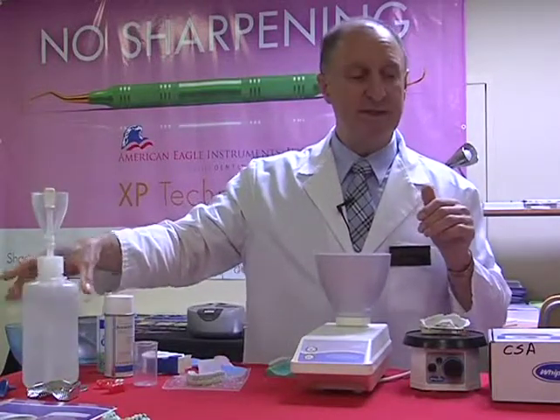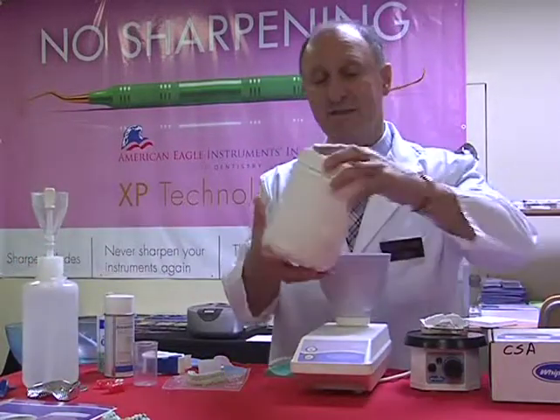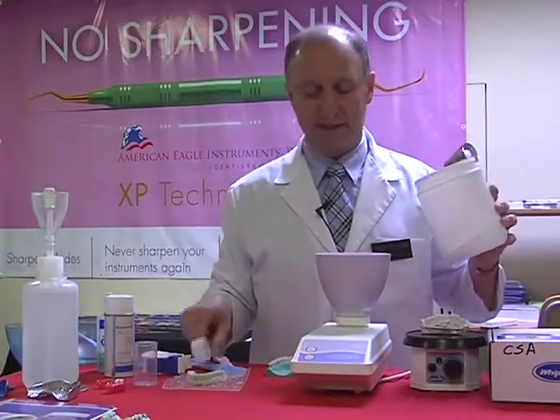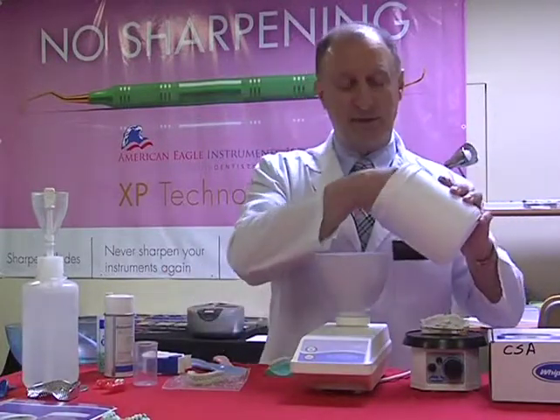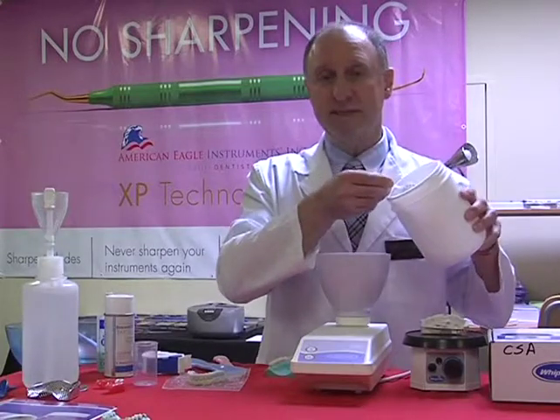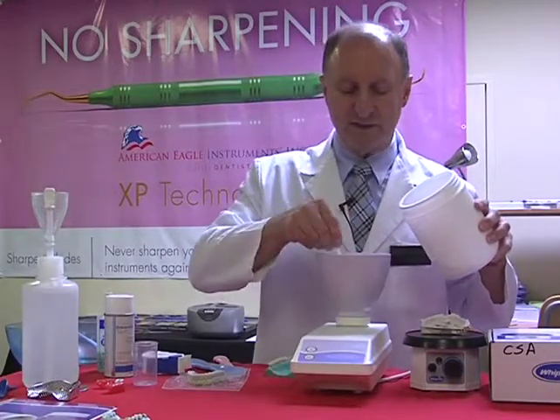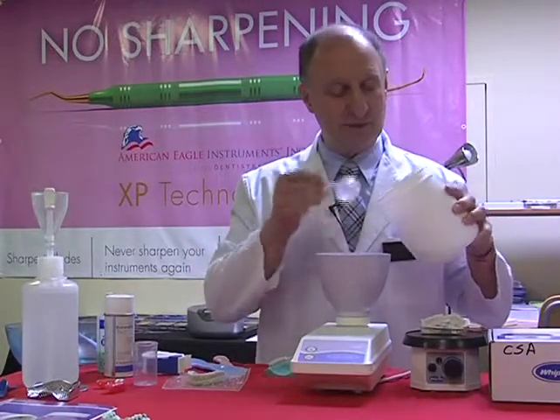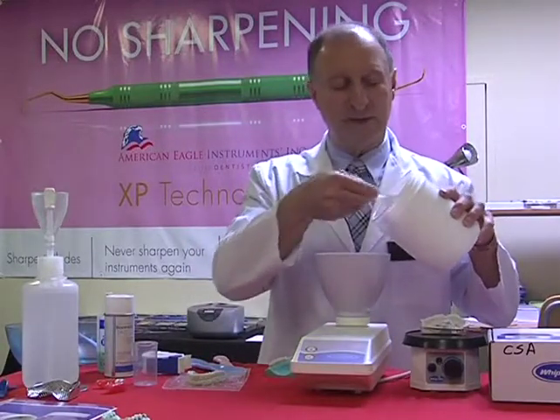Now at this point I'm going to use our stone. In this case I'm using a green stone. This has quite a long setting time, but it's got a nice working ability. What I'm going to do at this point is slowly sift the stone onto the surface. The stone will absorb into the water, and I'll turn this towards you in just a moment so you can see what's going to happen.